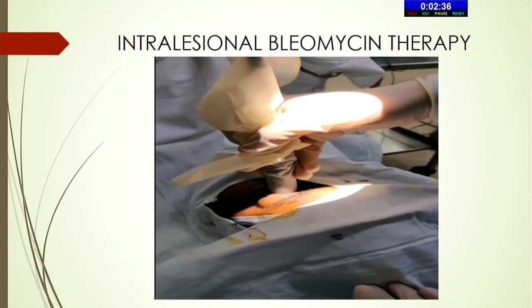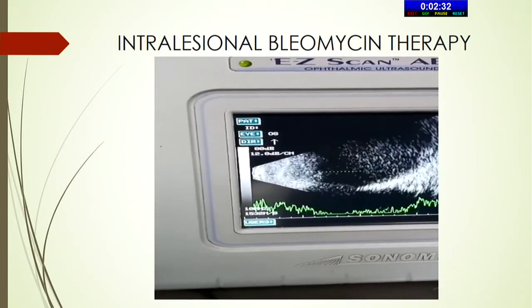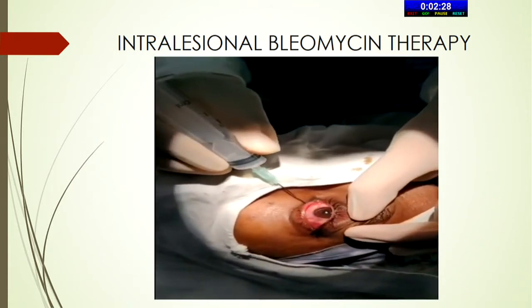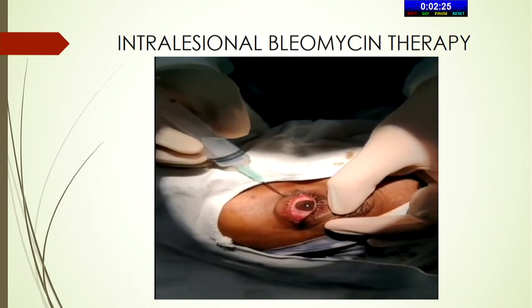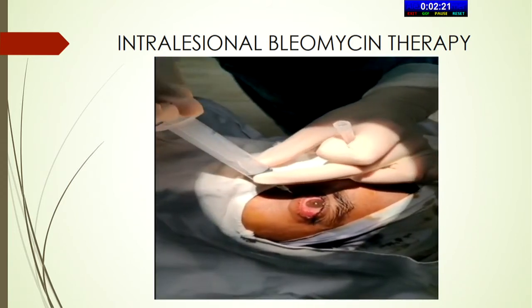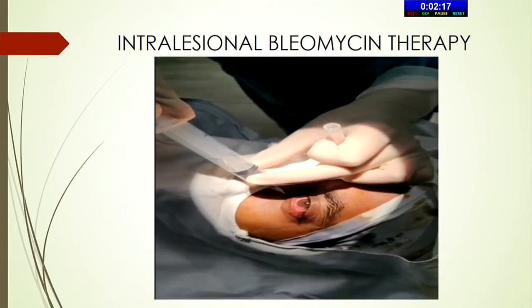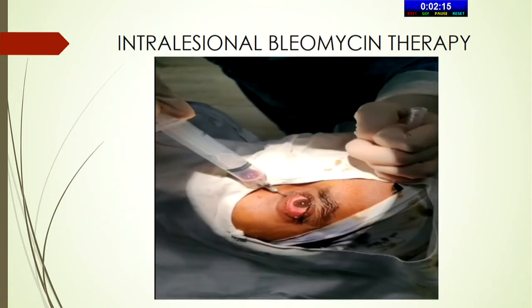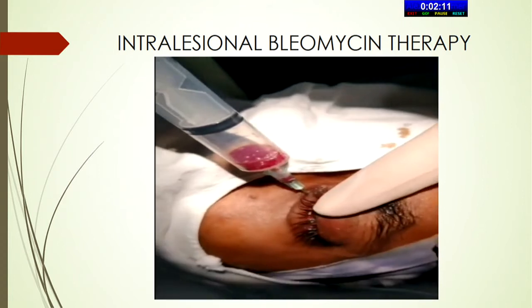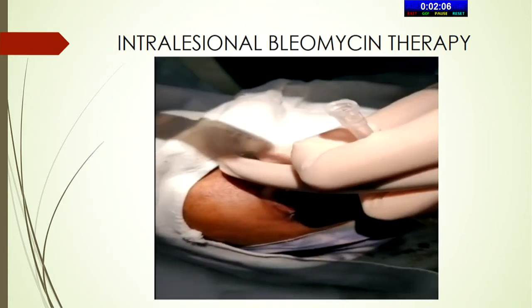So this is a short video. We are doing it under real-time ultrasound B-scan monitoring, after identifying the pocket on that and corroborating it, of course, with the MRI findings. We go in that quadrant, and then with a larger syringe which can cause more negative pressure, we try to aspirate the lesion. You can move the syringe a little forward and backwards to find the exact largest point where you can aspirate.